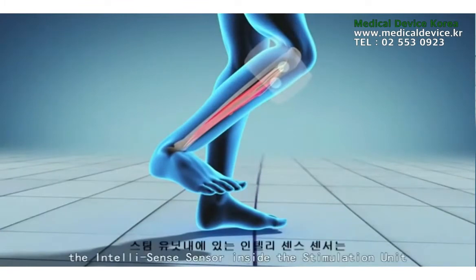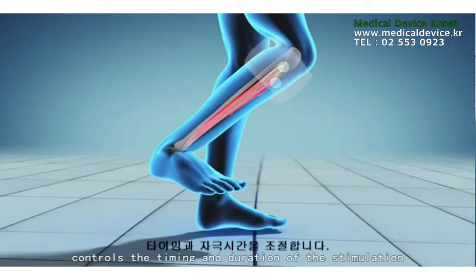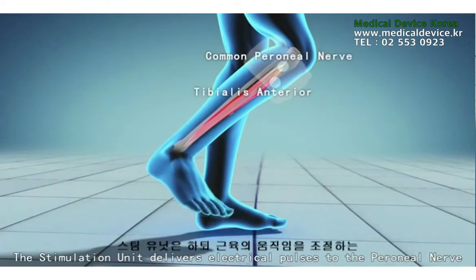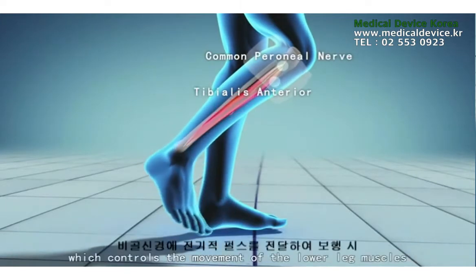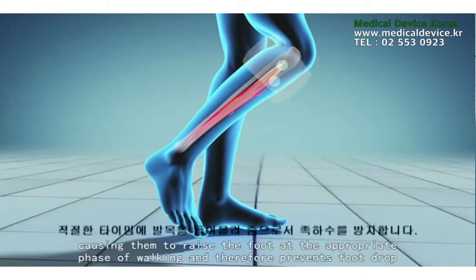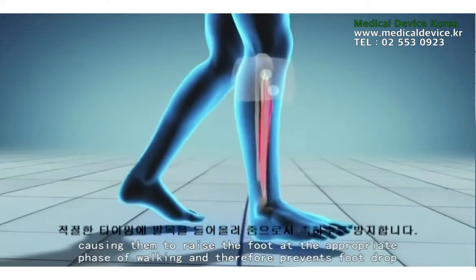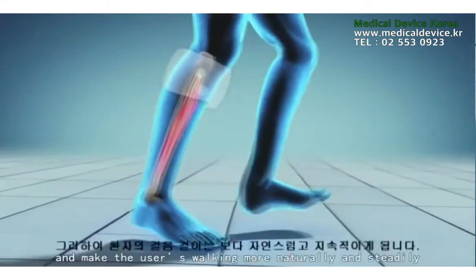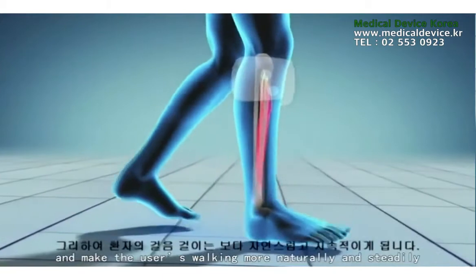The IntelliSense sensor inside the stimulation unit controls the timing and duration of the stimulation. The stimulation unit delivers electrical pulses to the peroneal nerve, which controls the movement of the lower leg muscles, causing them to raise the foot at the appropriate phase of walking. This therefore prevents foot drop and makes the user's walking more natural and steady.